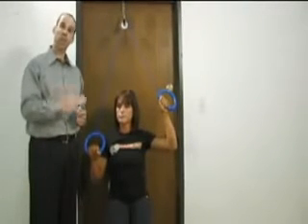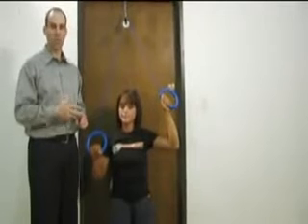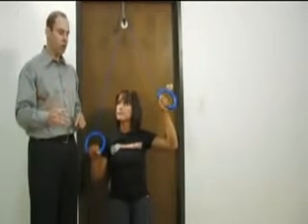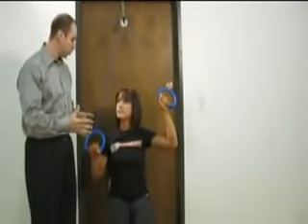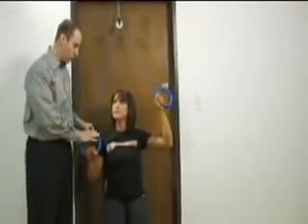Or if you're pre-surgical and you have something like frozen shoulder or just a shoulder injury that's been long-standing and you're looking for a way to gently stretch your shoulder with a little bit of progression, this is a great tool. So we're going to use the Marv shoulder pulley.